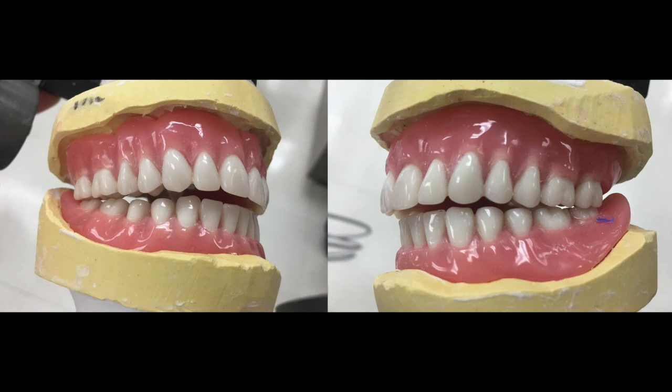And this is a clearer view. After this is a clinical remounting, let's see how much the occlusion is off on the same denture. As you notice, this denture only has second molar contact, no other teeth. So this happens when the initial bite registration has an error, then the final denture will not be in correct occlusion.